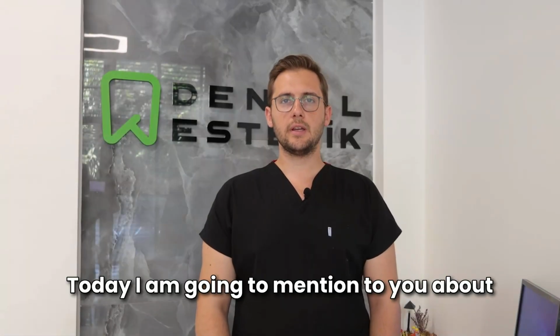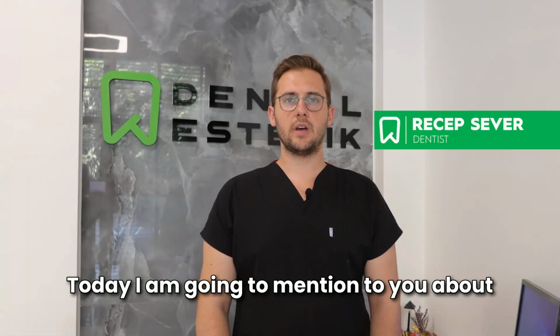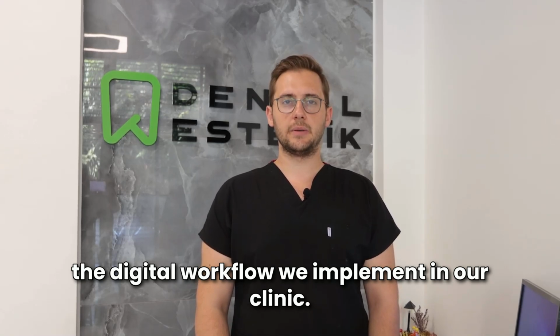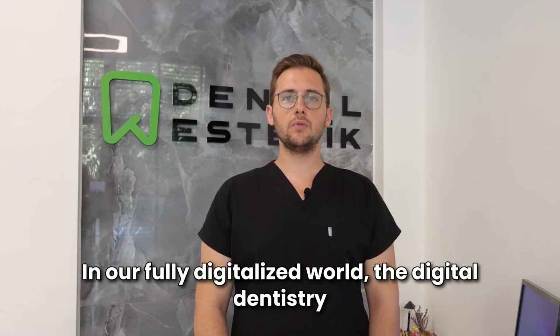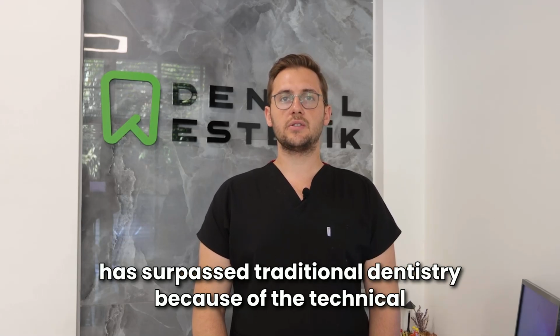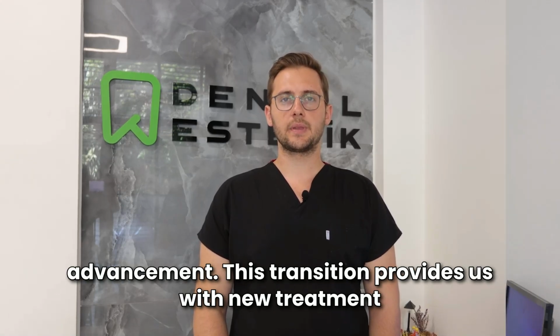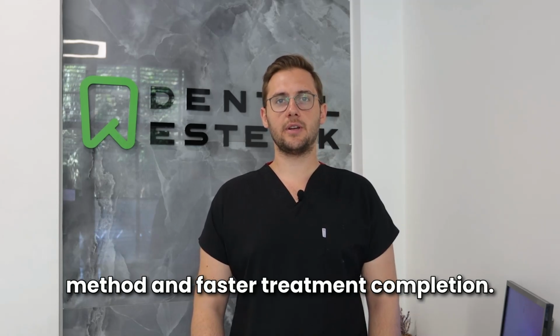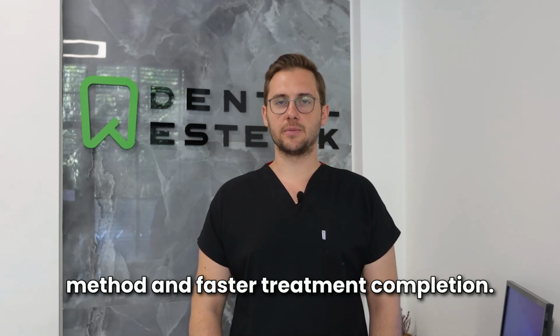Hello, today I am going to tell you about the digital workflow we implement in our clinic. In our fully digitalized world, digital dentistry has surpassed traditional dentistry because of technical advancement. This transition provides us with new treatment methods and faster treatment completion.